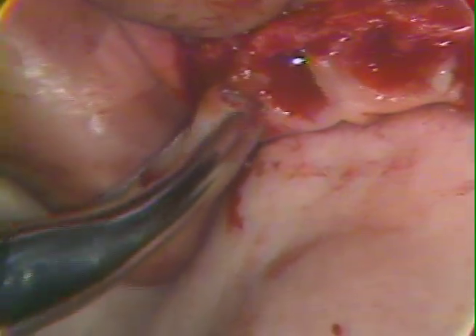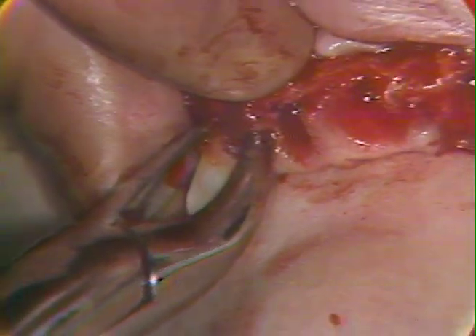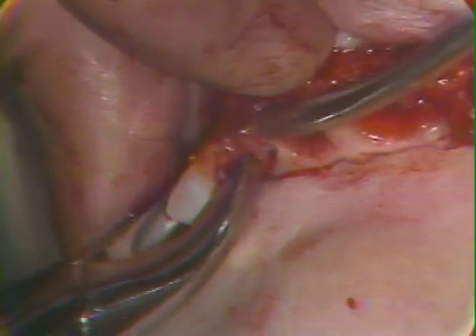Well, one thing we might show here, sometimes the lateral incisor has a root configuration with a dilaceration to the distal. In that event, it can be grasped mesiodistally and given some motion to the distal as well, and that can often compensate for that particular peculiarity of the lateral. So we're rotating and moving it somewhat to the distal as it delivers.